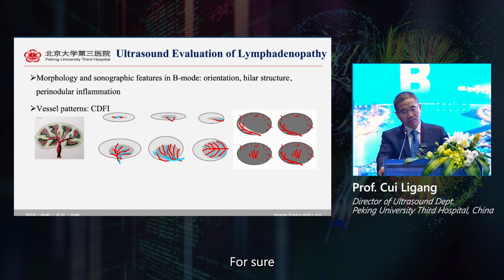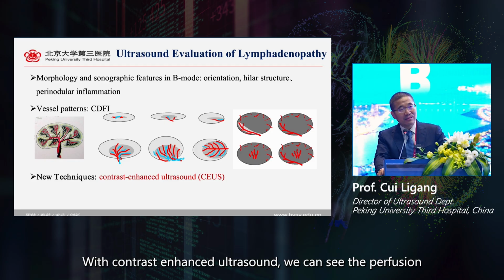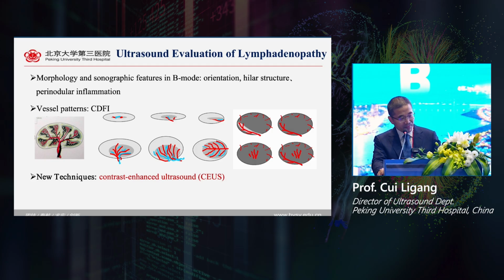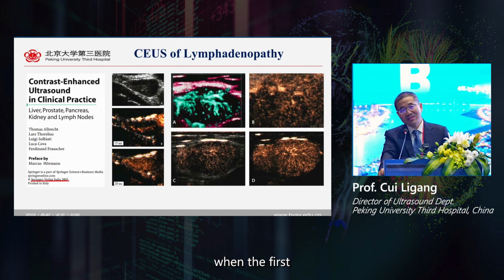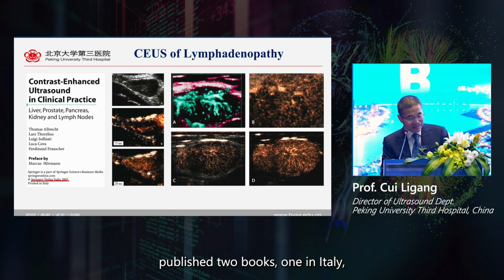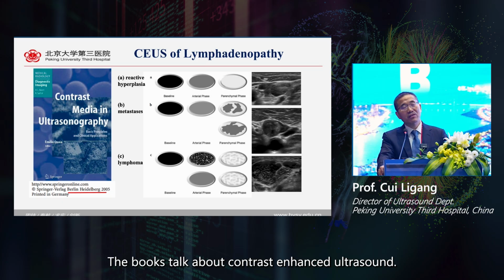For sure, we are thinking about how about bubbles. With contrast enhanced ultrasound, we can see the perfusion very clearly. And definitely, about 20 years ago, when bubbles first appeared in the ultrasound field, Springer published 2 books, one in Italy, another one in Germany. The books talk about contrast enhanced ultrasound.